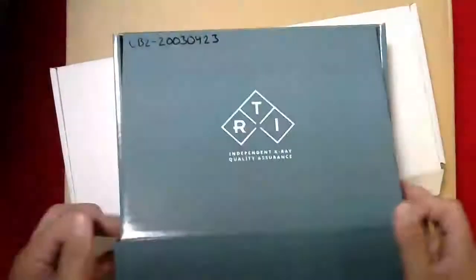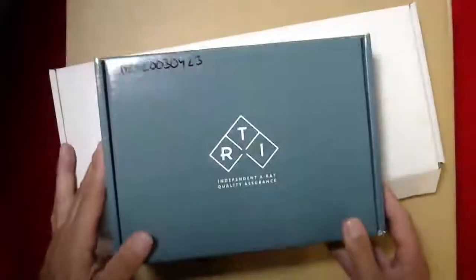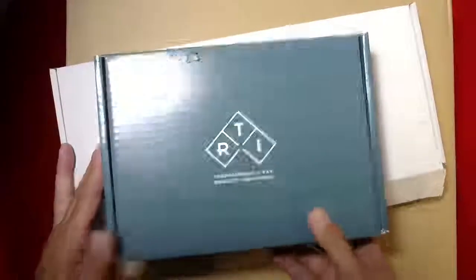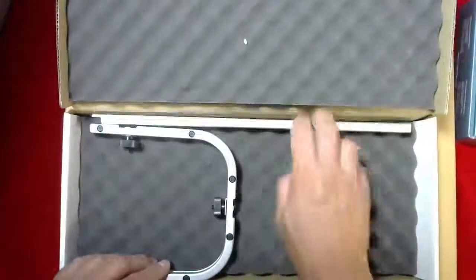This particular box has the manuals in it — the printed manuals, which is kind of handy — but the manuals are also available on the software that comes with the meter as well as a PDF version, so digital and hard copy.